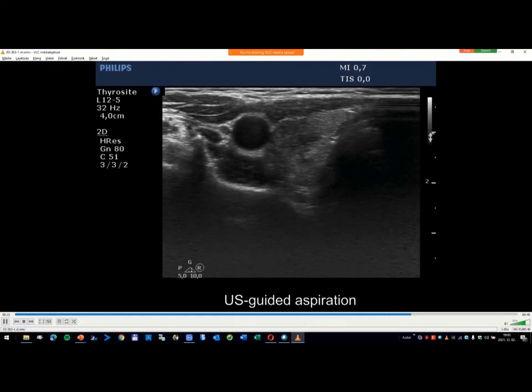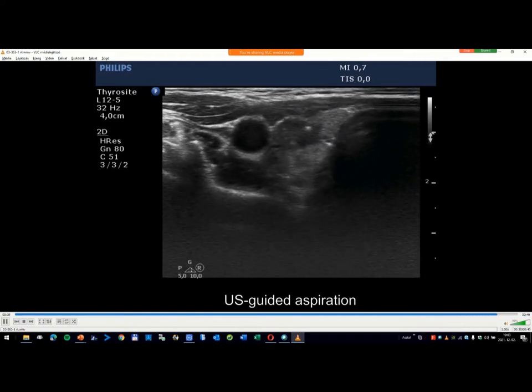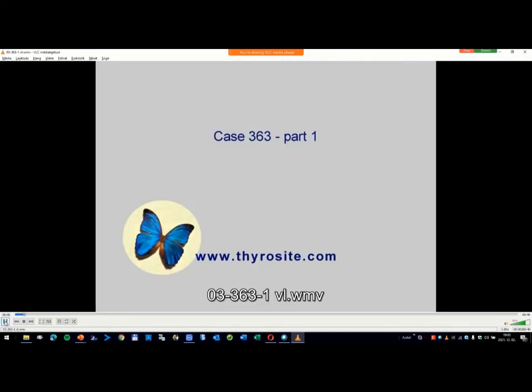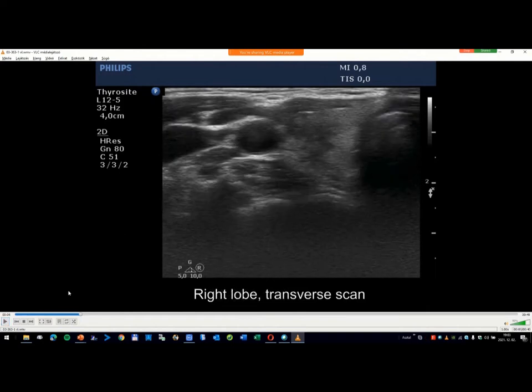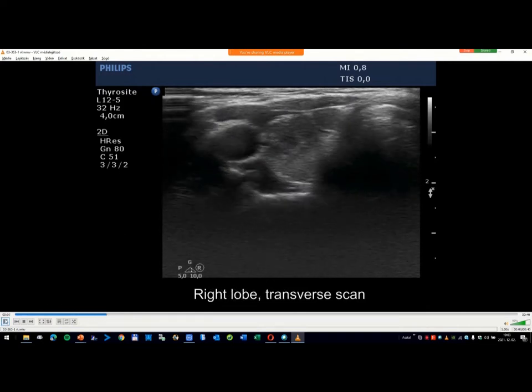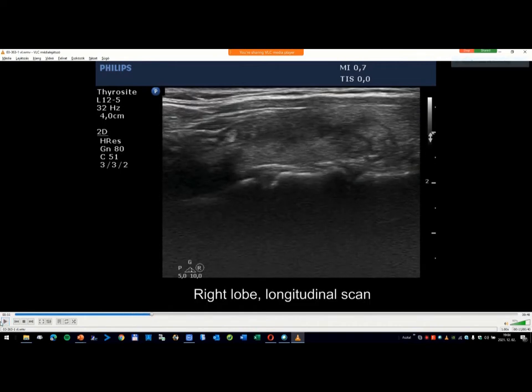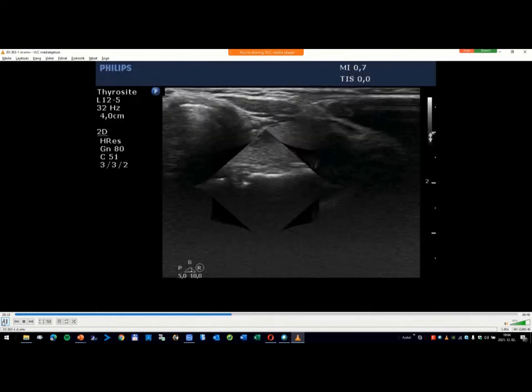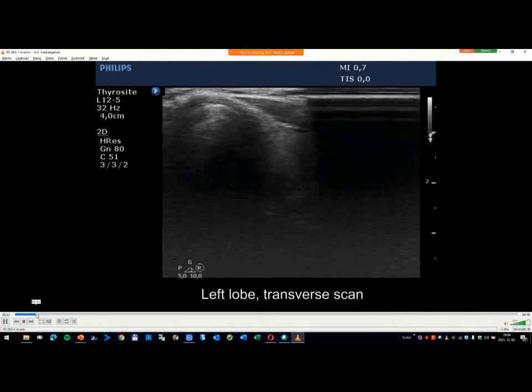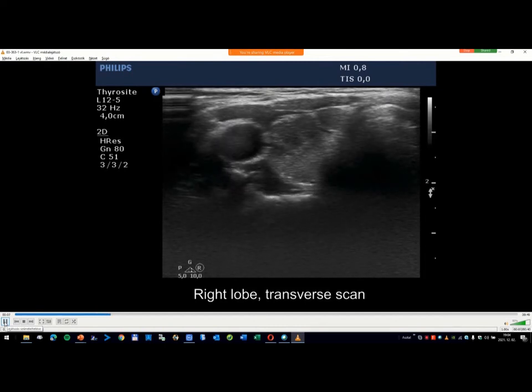This is a very specific pattern of thyroiditis and this patient had some tenderness in her right thyroid. She was presented in my order as having a very suspicious TIRADS 5 lesion. Therefore, I performed aspiration cytology which resulted in subacute thyroiditis. Now, let's see the borders of this lesion. It is quite clear that this region has partly blurred, partly lobulated margins.